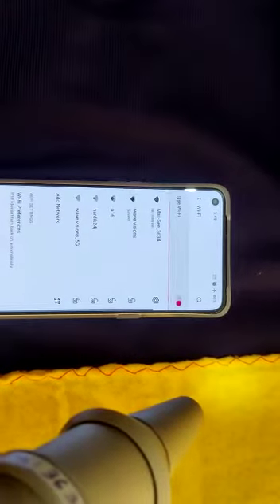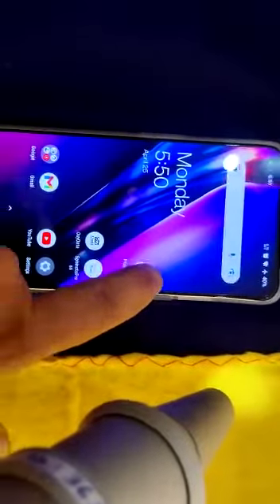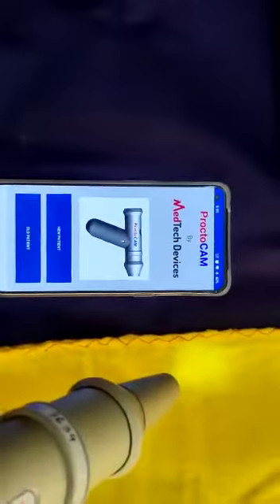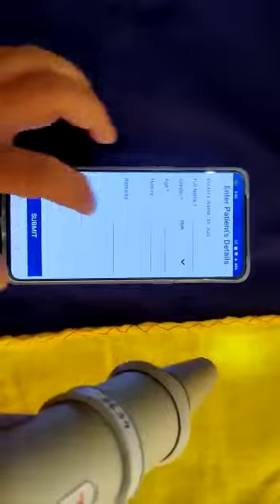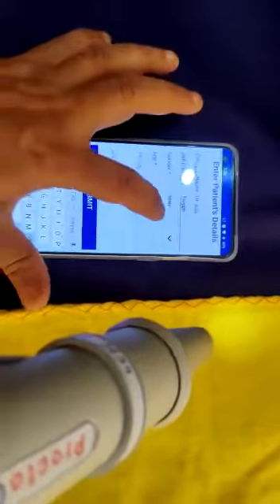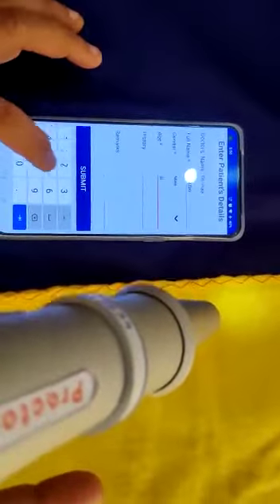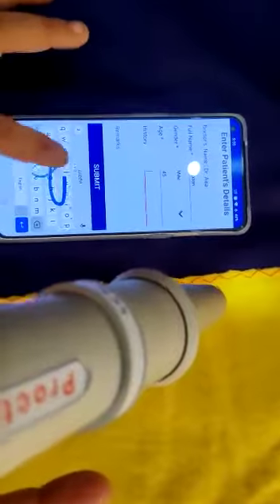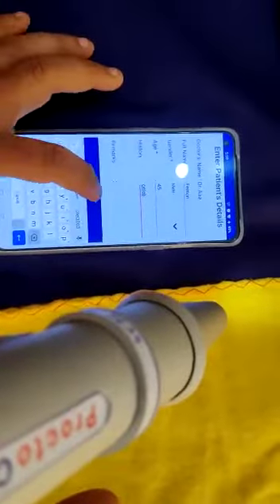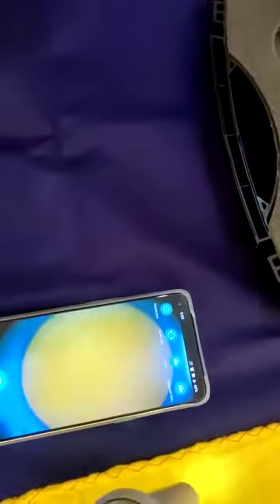Once paired, go to ProctoChem app, enter patient details, and online mode you are ready. So you can see.